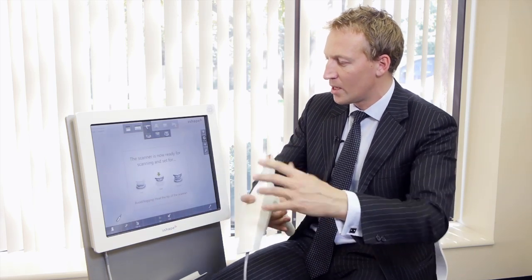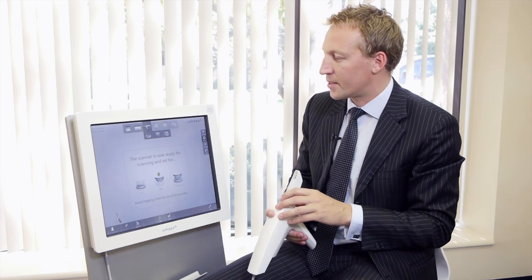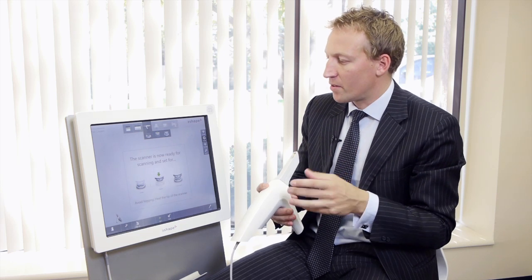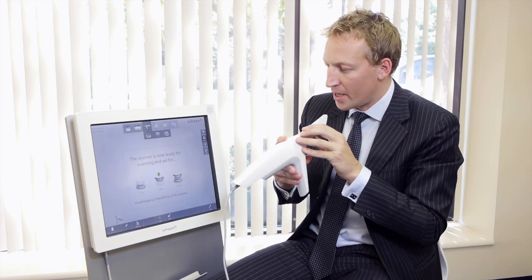So I'm just going to go ahead here, scan. Again, no powder or anything. So you can just directly go ahead.